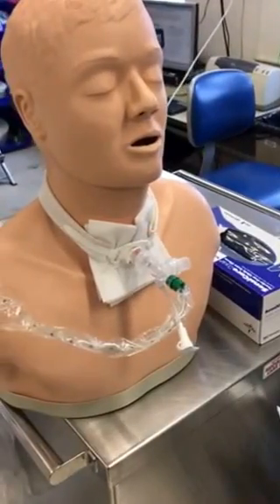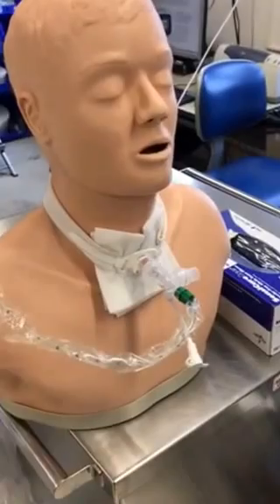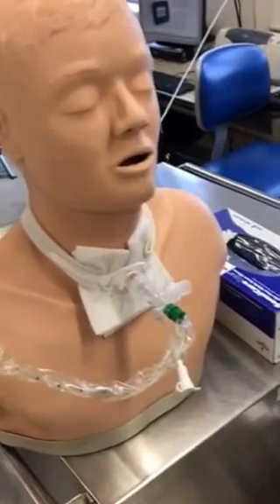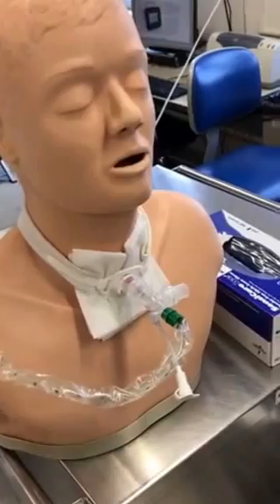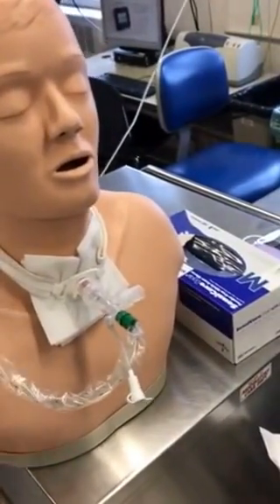Hello. If you're watching this, it's because you're a student who wants to learn more about MIE, which is mechanical insufflator-exsufflator, also known as mechanical cough assist or machine cough. But this also corresponds to my other topic, which relates to it, spinal cord injuries.